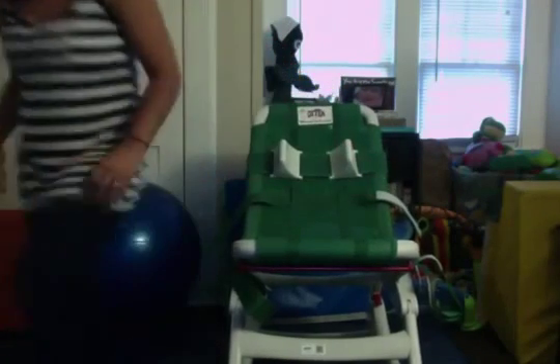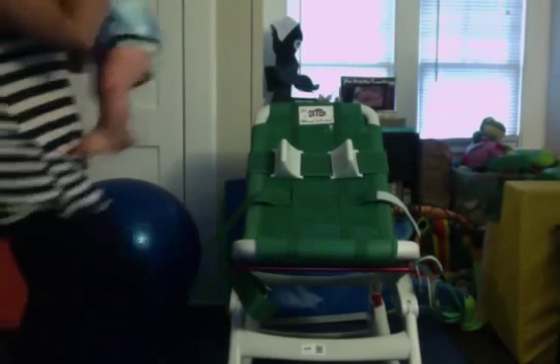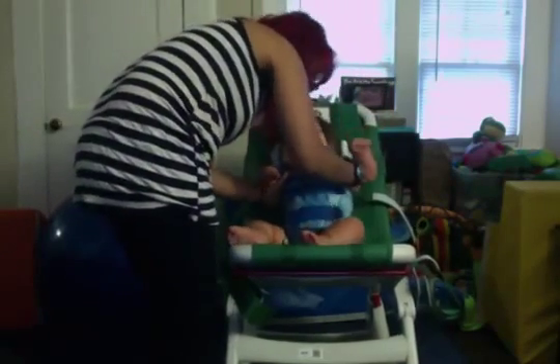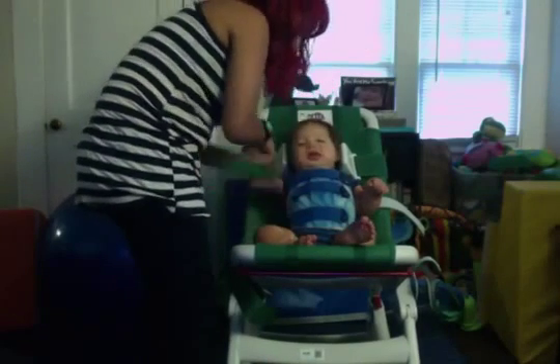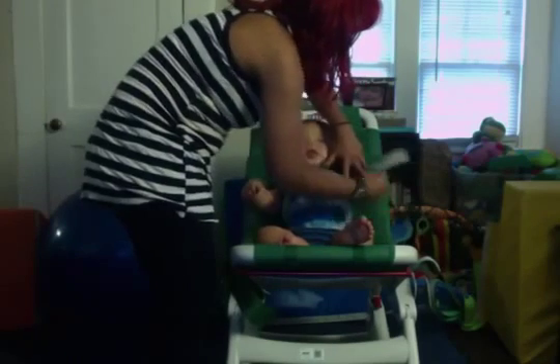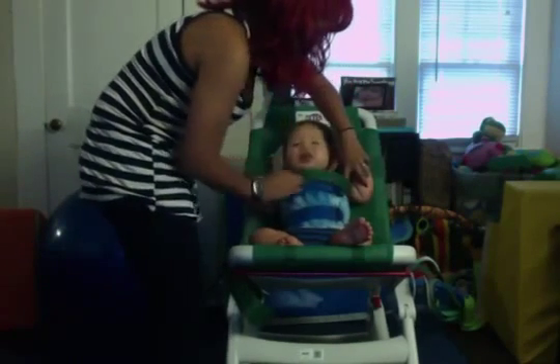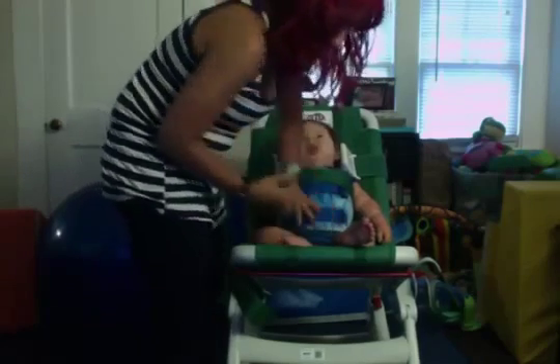This is Parker — say hello! We've got the chest strap, put that across. I like this because it keeps him from sliding down so much. Then you get the lap belt.